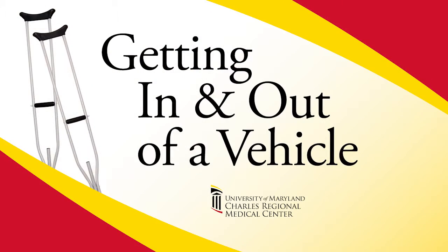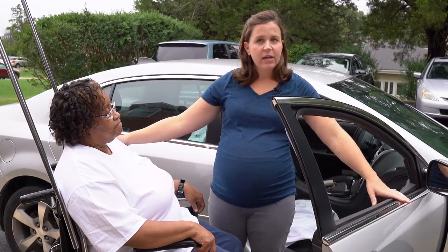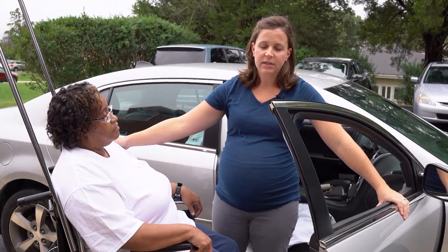When it's time to leave the hospital, we want to make sure that you can get into the vehicle very safely. I find that rolling the window down on the passenger side can give you another place to grip with your hand and help you safely get into the car.